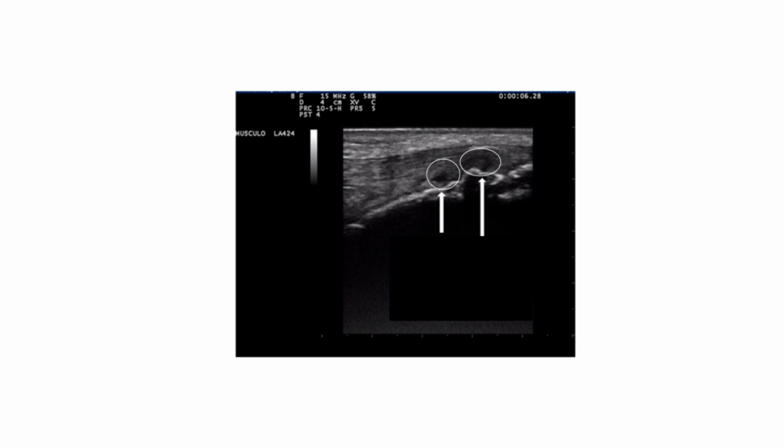Next, we will observe the patellar tendon above the tibial tuberosity. There is a hypoechoic area below the patellar tendon and a hypoechoic area with an unclear fibrillar pattern on the patellar tendon. Therefore, patellar tendonitis is also considered to be involved.